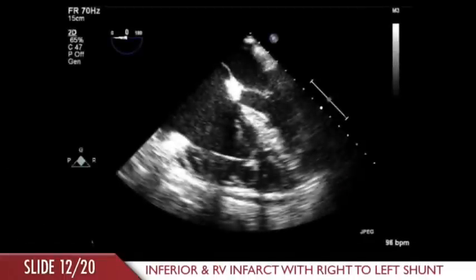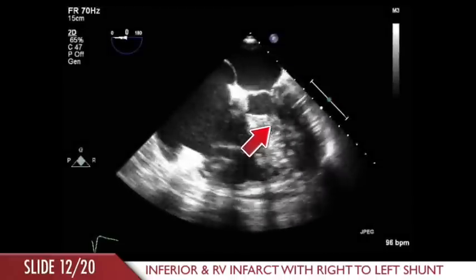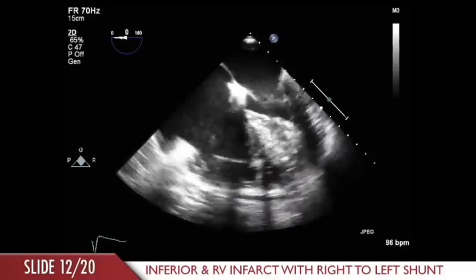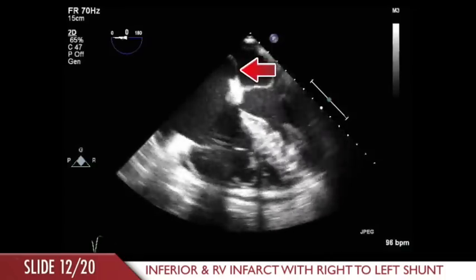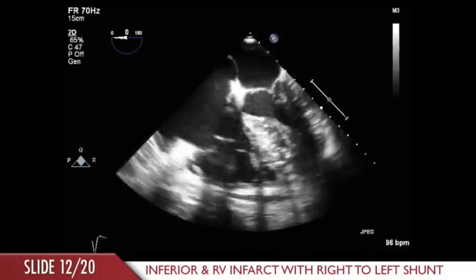This transesophageal echocardiogram was recorded in a patient with a limited inferior myocardial infarction, hypotension, and hypoxia. Note the normal function of the left ventricle, which appears to be underfilled, and a dilated hypokinetic right ventricle and marked dilation of the right atrium. Also, note the bowing of the atrial septum from right to left, suggesting substantial right atrial hypertension.